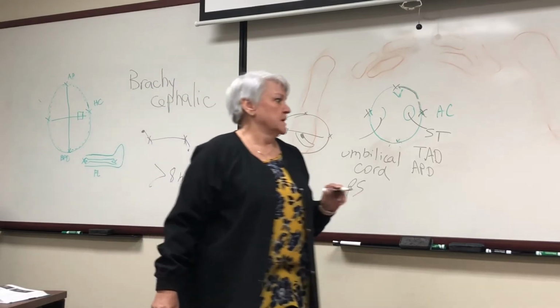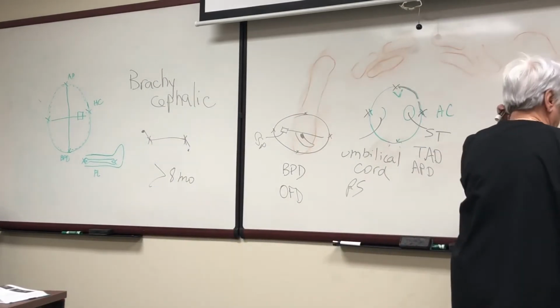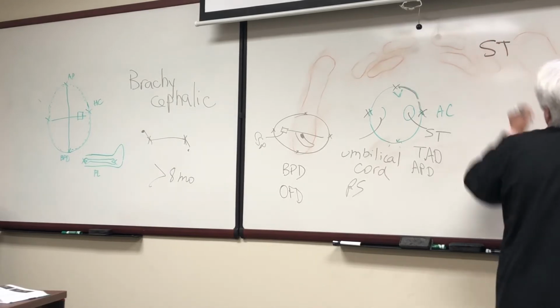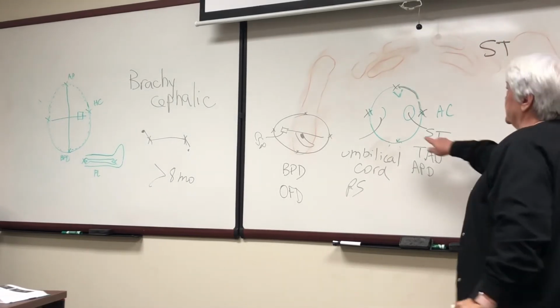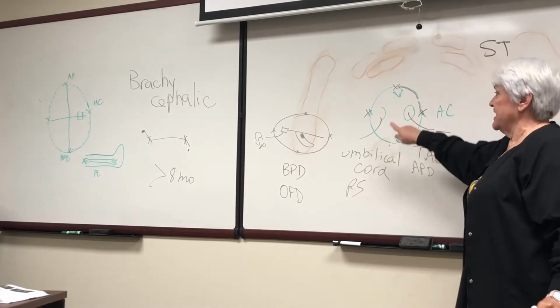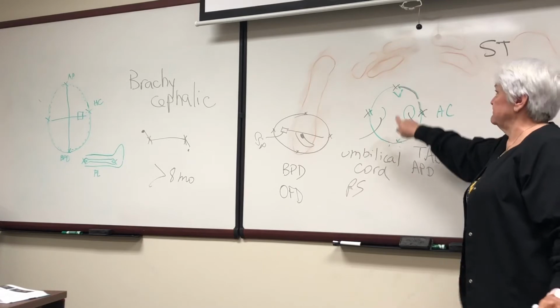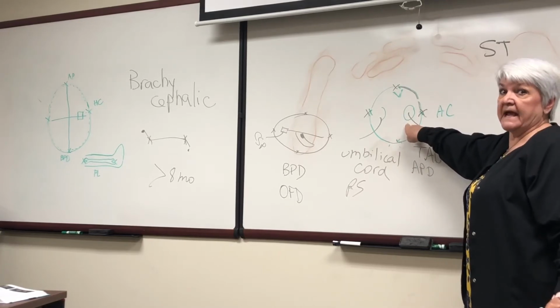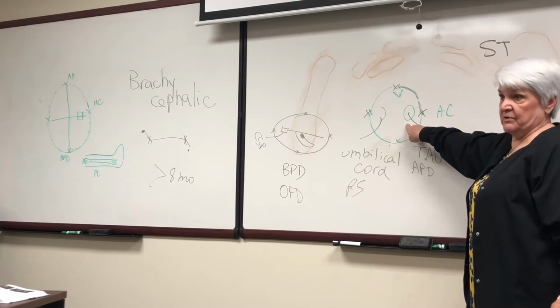Now, other views that you have to do. Stomach. You can use the same image, just take the calipers off, change your annotation, stomach. Okay, so that's going to cut down on the speed of your exam.